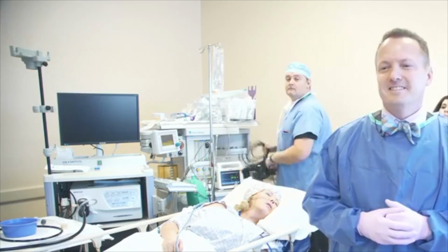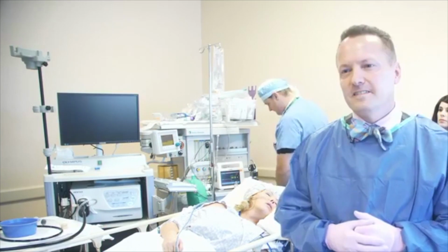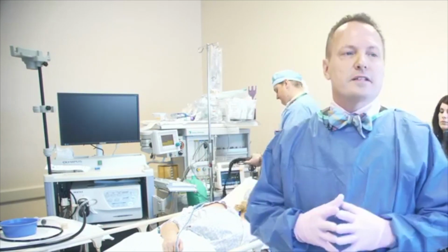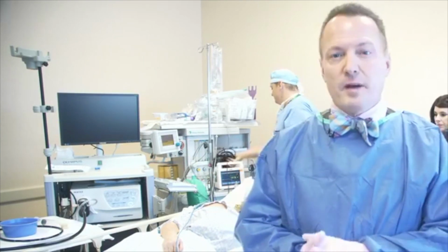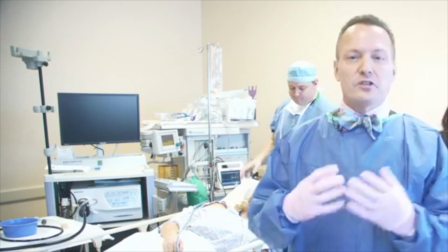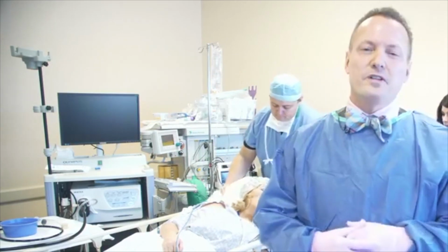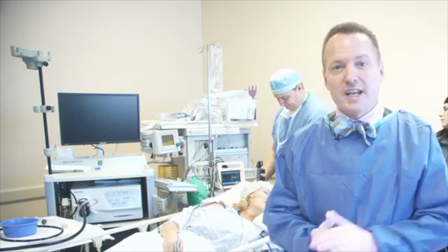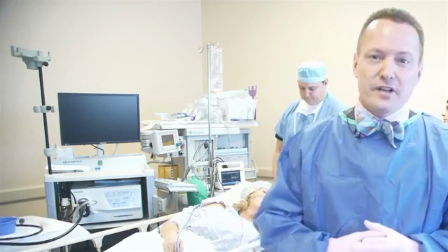And Leslie's here with us. She would like to know, is there any possible side effects with the balloon? So people asked about side effects. Side effects after insertion, maybe the nausea, sometimes vomiting. But otherwise, in general, it's very durable. There's nothing that you can swallow or eat that's going to harm the balloon. It sustains all temperatures. You can fly on an airplane. You can go through an airport security device and it's not spotted.